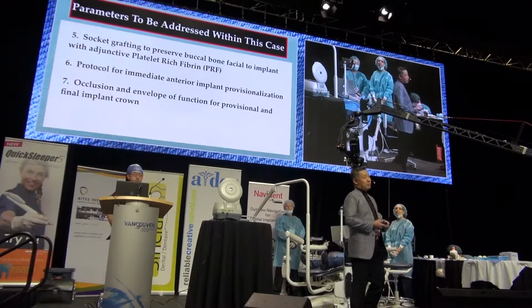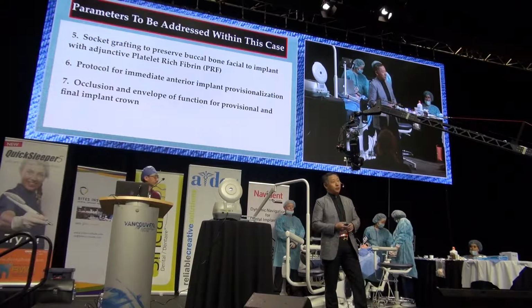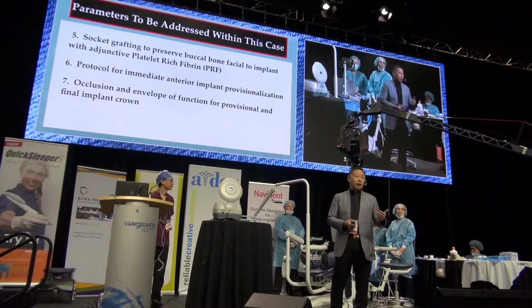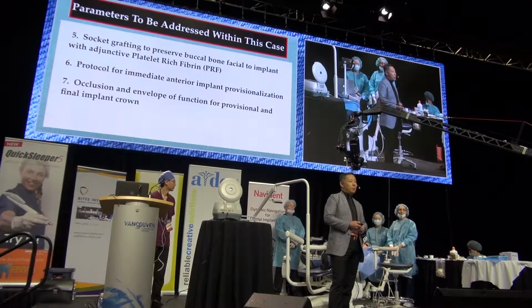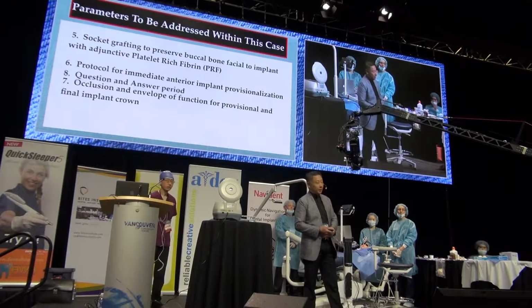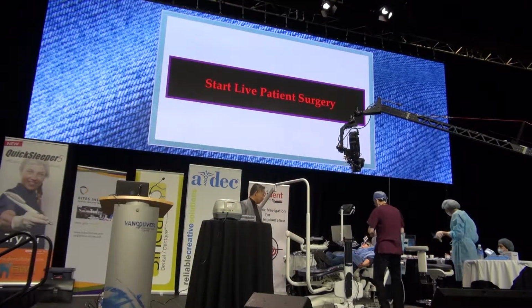As an aside, my master's thesis from 2006 to 2009 was specifically on this topic, single implants in the anterior zone. And through my studies, we found certain etiological factors that unfortunately compromise the longevity of these teeth. It has a lot to do with occlusion, or else things will not snap at the gum line. Okay, so Dr. Kwan is going to prepare the PRF.